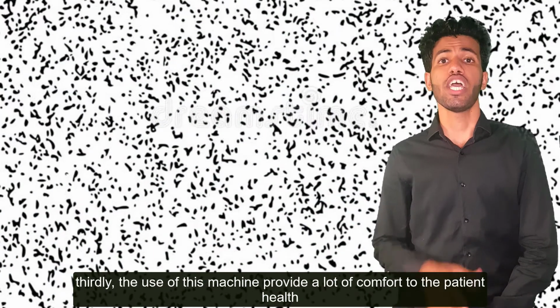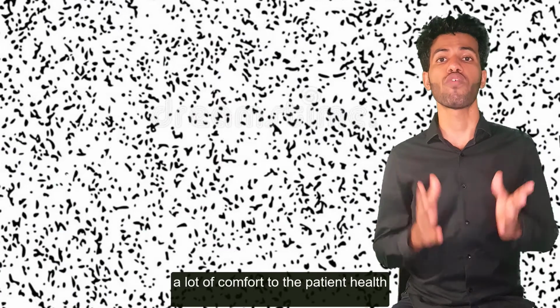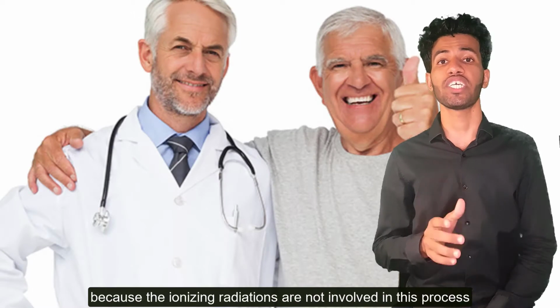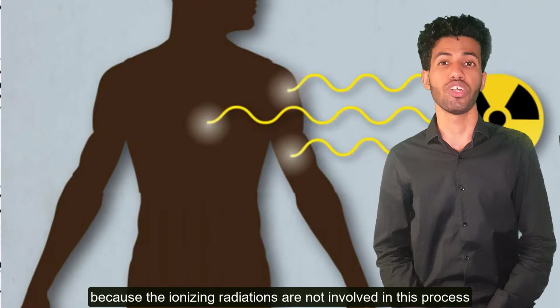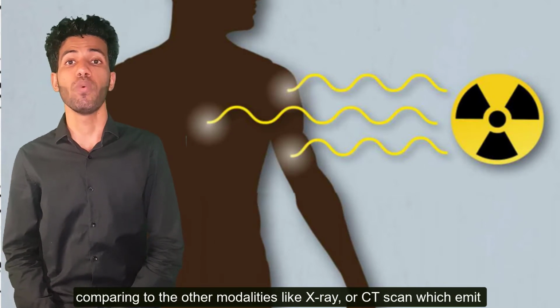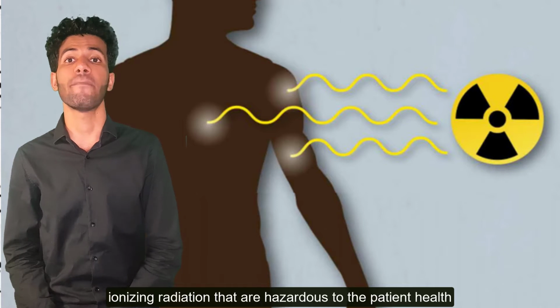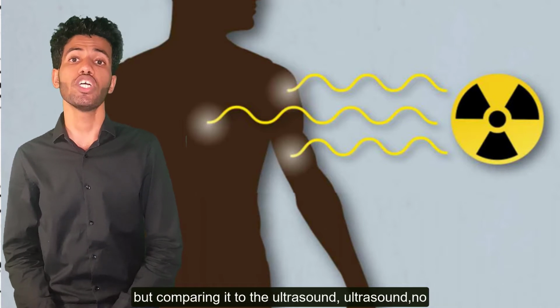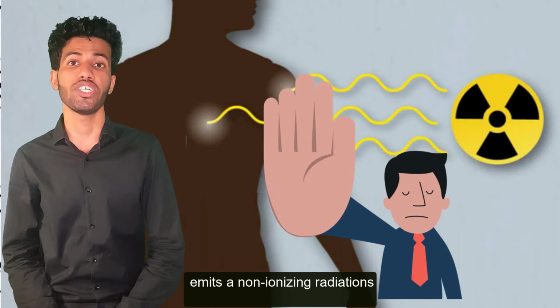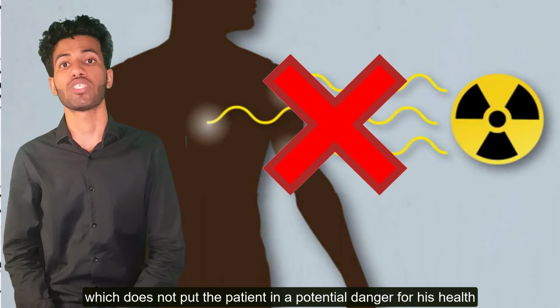Thirdly, the use of this machine provides a lot of comfort to the patient's health, because ionizing radiation is not involved in this process, compared to other modalities like X-ray or CT scan, which emit ionizing radiation that is hazardous to the patient's health. Ultrasound, in comparison, emits non-ionizing radiation, which does not put the patient in potential danger.